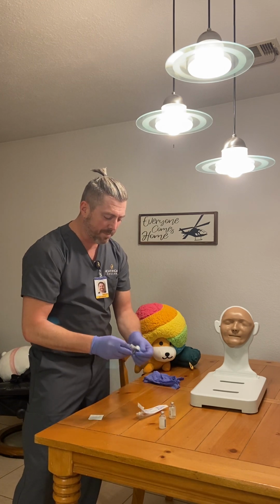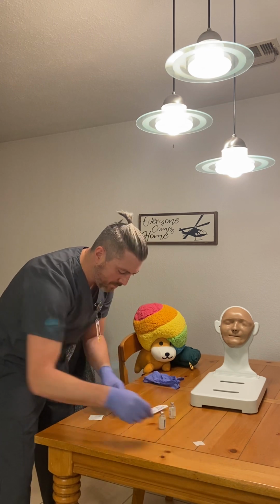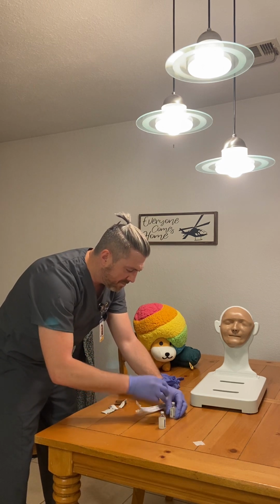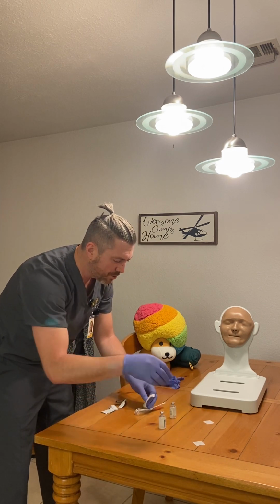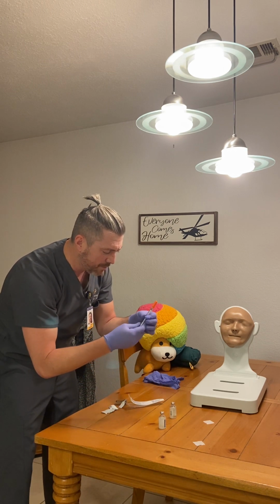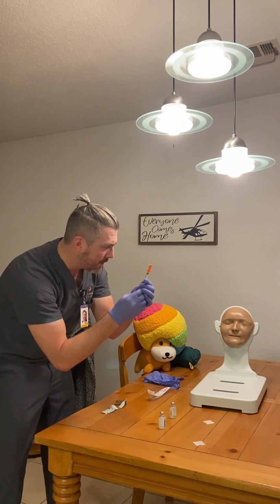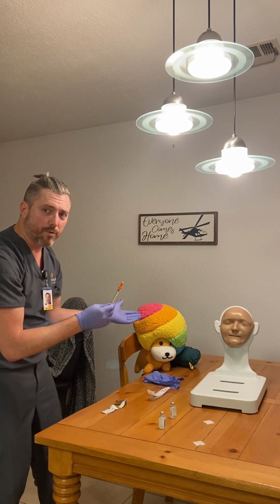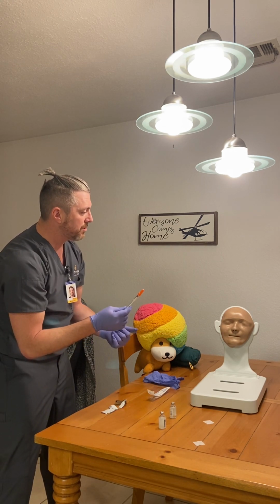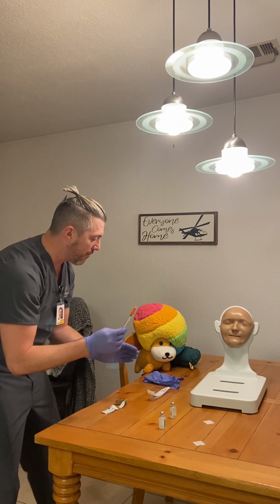I'm going to clean the top of them and let that dry. I'd be throwing this away. So first we've got our syringe from new package. I have my nurse in the room at this moment that's going to go over everything with me. And you might feel stinging or burning at the injection site, okay? So my nurse is going to verify everything here.